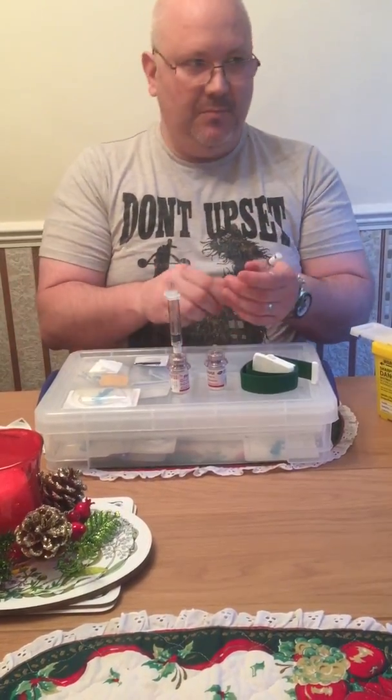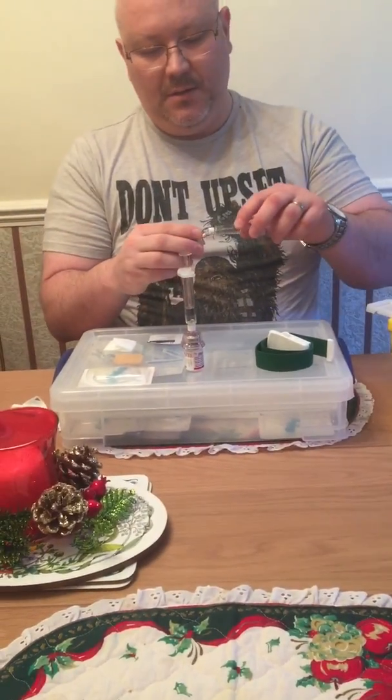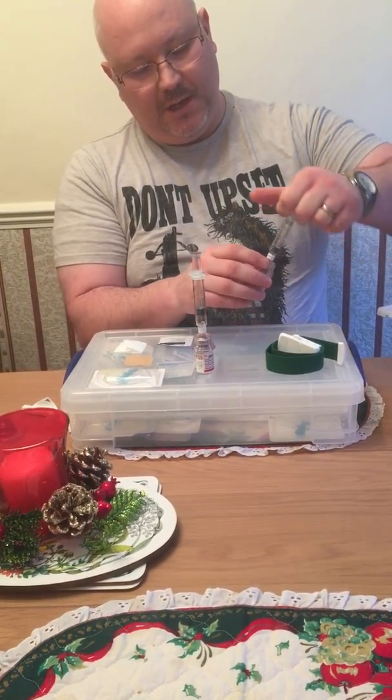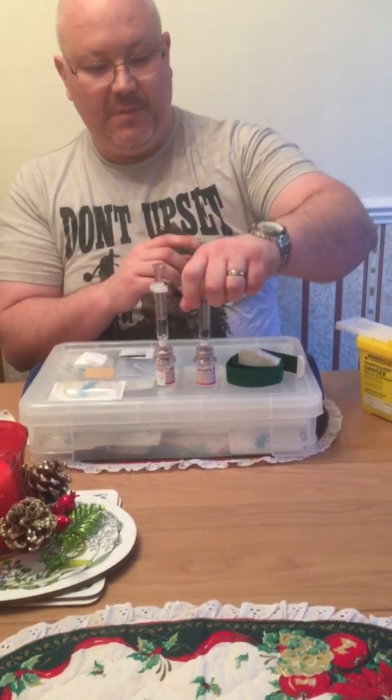I'm going to leave it there to dissolve a little bit more. Then snap the next top off, put it in, connect and do the same. Give it a shake for a little bit of mix.